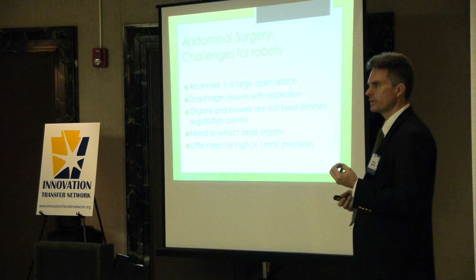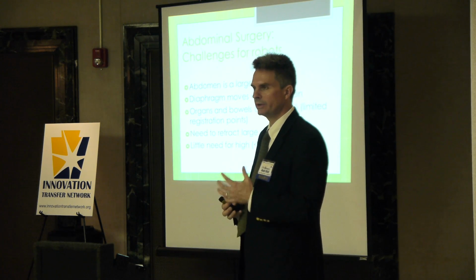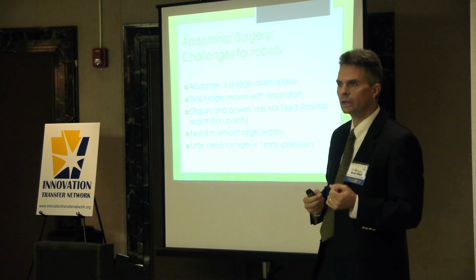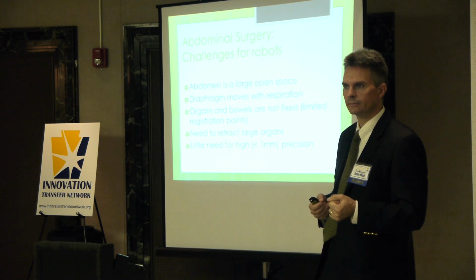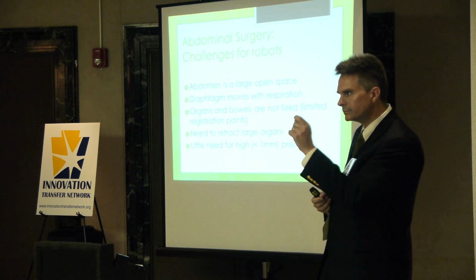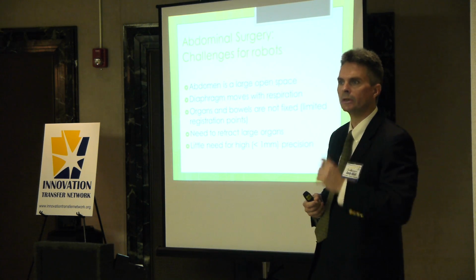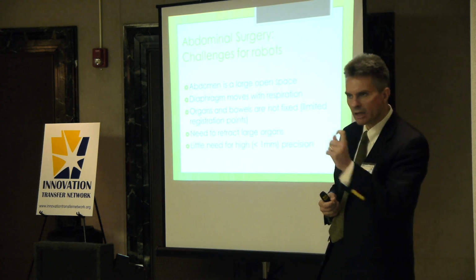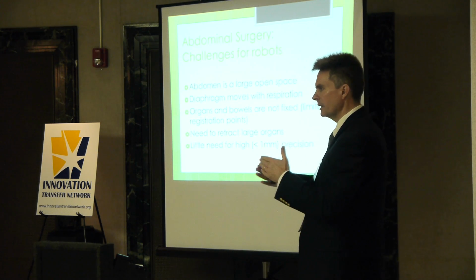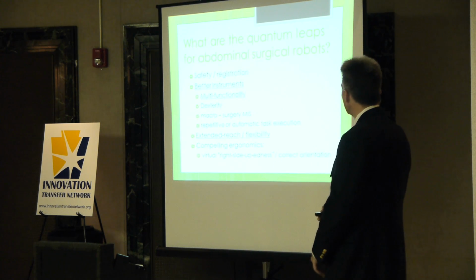And one interesting factor is that most of the operations we do, I mean, please don't tell any surgeons I said this, but there's relatively little need for ultra-high precision. We think of surgery as being precise, and it is, but it's not nanoscale precise. It's not even mostly sub-millimeter precise. It's around a millimeter precise, where you put sutures and where you make cuts and things like that. So again, what are robots good at, and what are our needs?